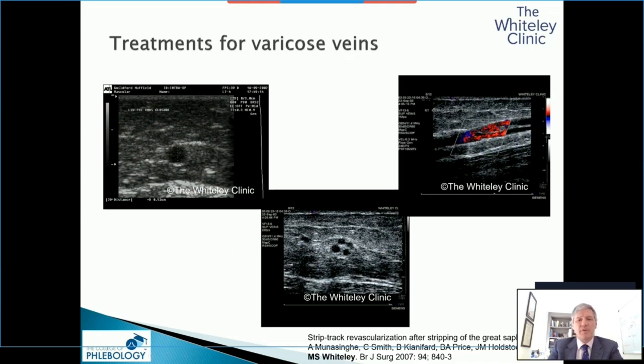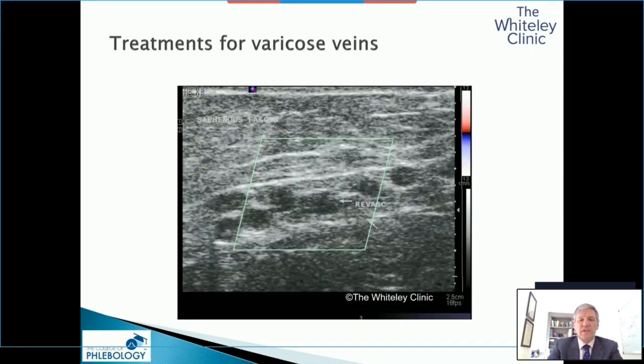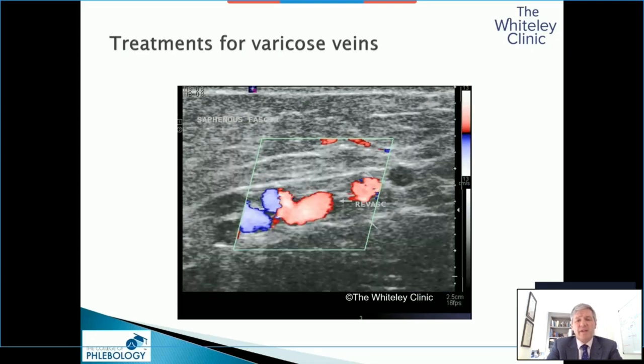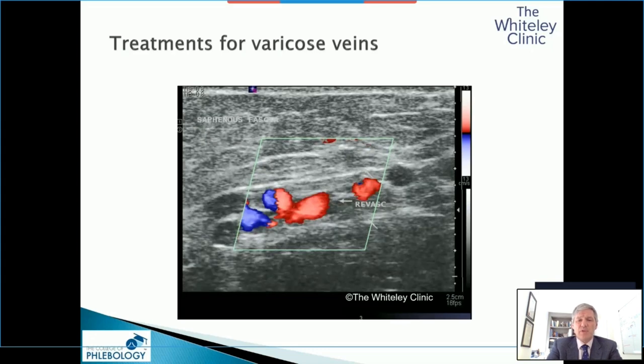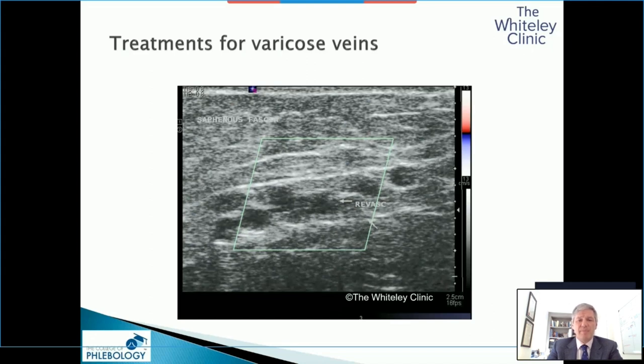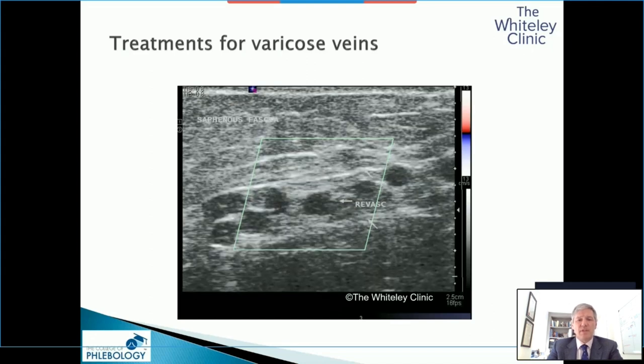For many years, people wouldn't believe this happened, but this is a duplex ultrasound showing strip tract revascularization. These are new vessels that have grown in a tract that was stripped and proven to be stripped, both by ultrasound at the time and also clinically by measuring the vein on the outside. We've followed these patients up now for over eight years to show what can happen, and we see this happening with increasing regularity.